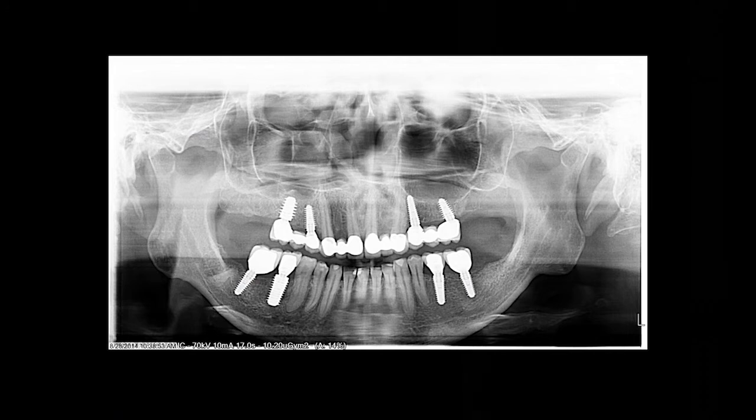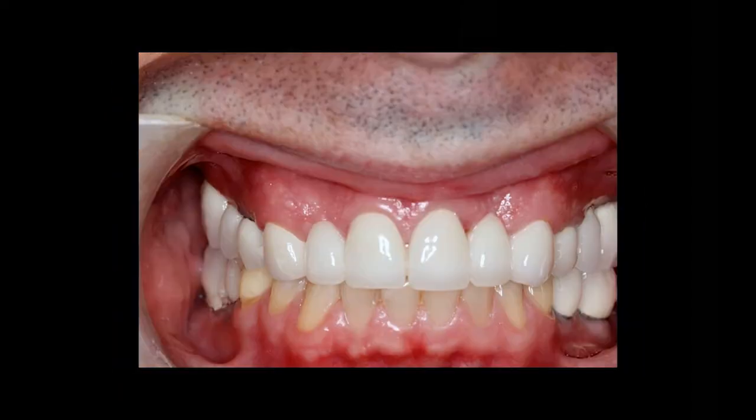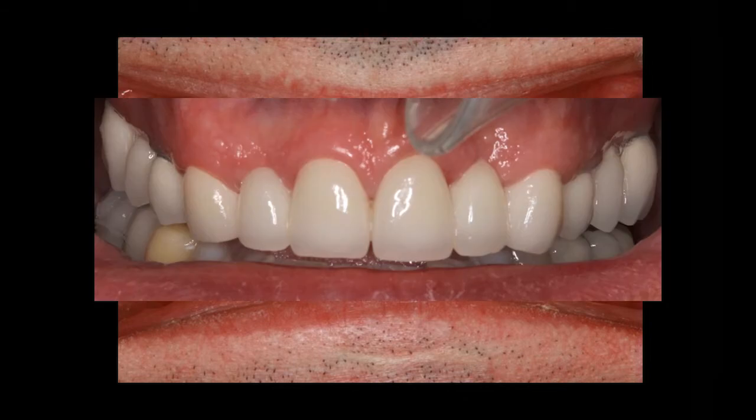These are all AnyRidge implants. Just really super result. Looks good in the mouth. Looks good on the x-rays and all that. And this is the day we put the case in. So everything's kind of bloody. This is after he's healed for a week or so. Right side, left side, he's bleaching right now. That's before. This is after.